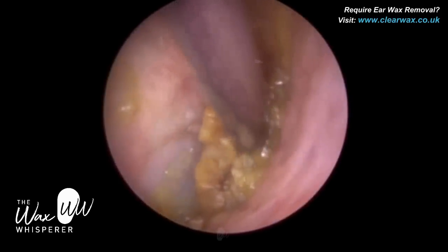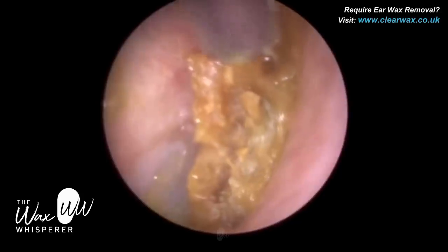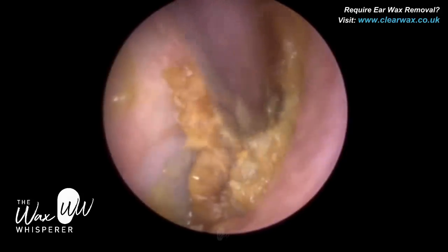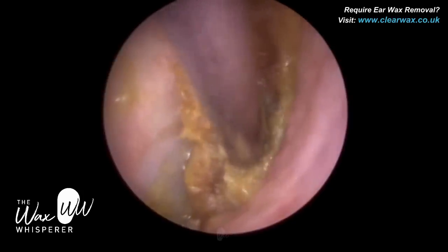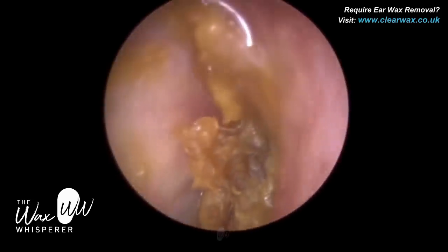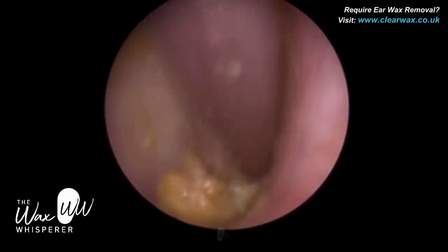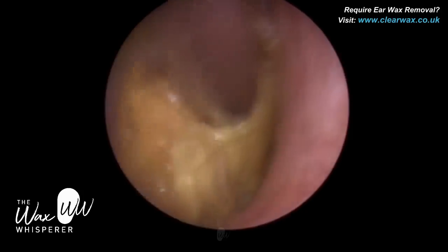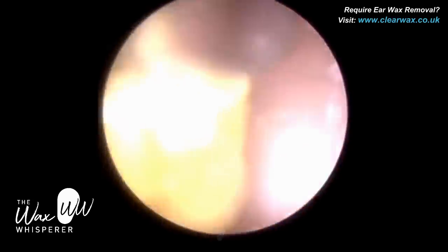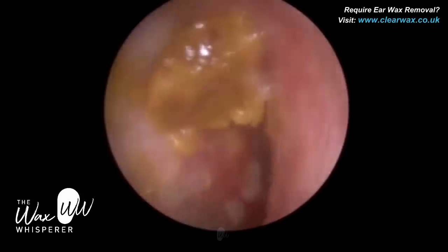I'm just using a fine end gauge, which is an extension to the standard Zonar suction probe — a narrower, smaller suction tip. Although it's less powerful, it's also less noisy, which is always recommended when working closer to the eardrum, as microsuction can be quite noisy. I find a fine end gauge also provides more precision, so for delicate procedures near the eardrum I much prefer it. However, as was the case here, the fine end gauge just wasn't powerful enough, so I had no option but to revert to the standard Zonar suction probe. And you can see it's quite a startling piece of soft wax that I've managed to extract.